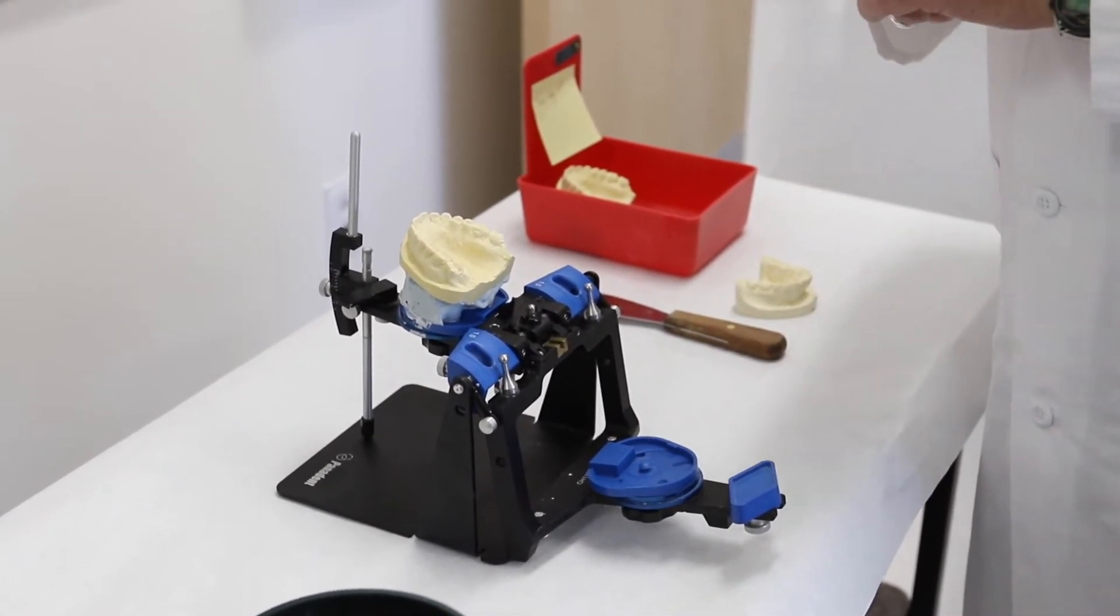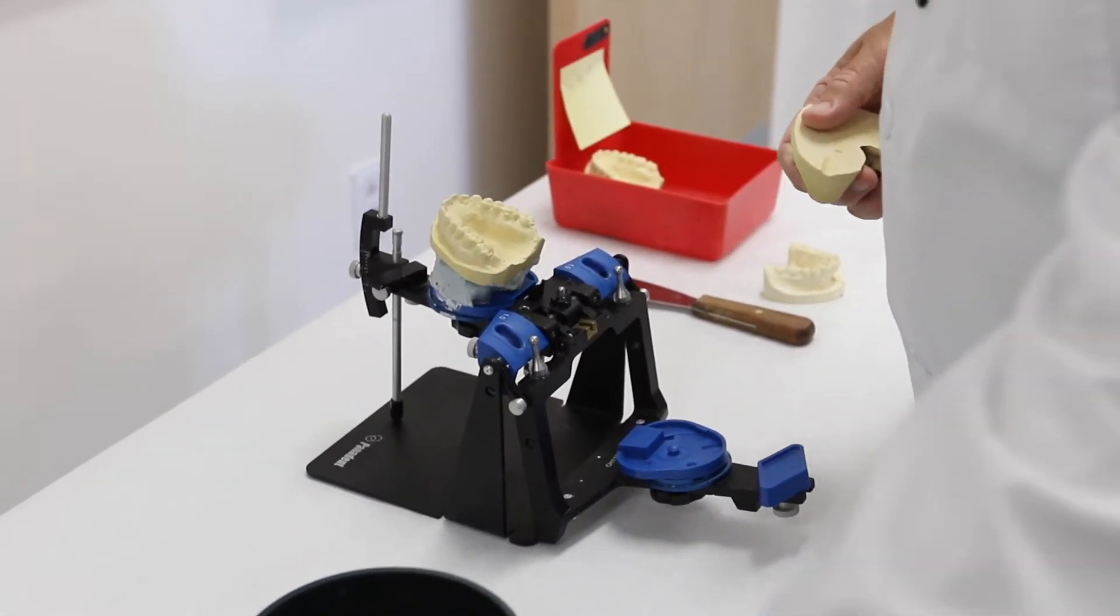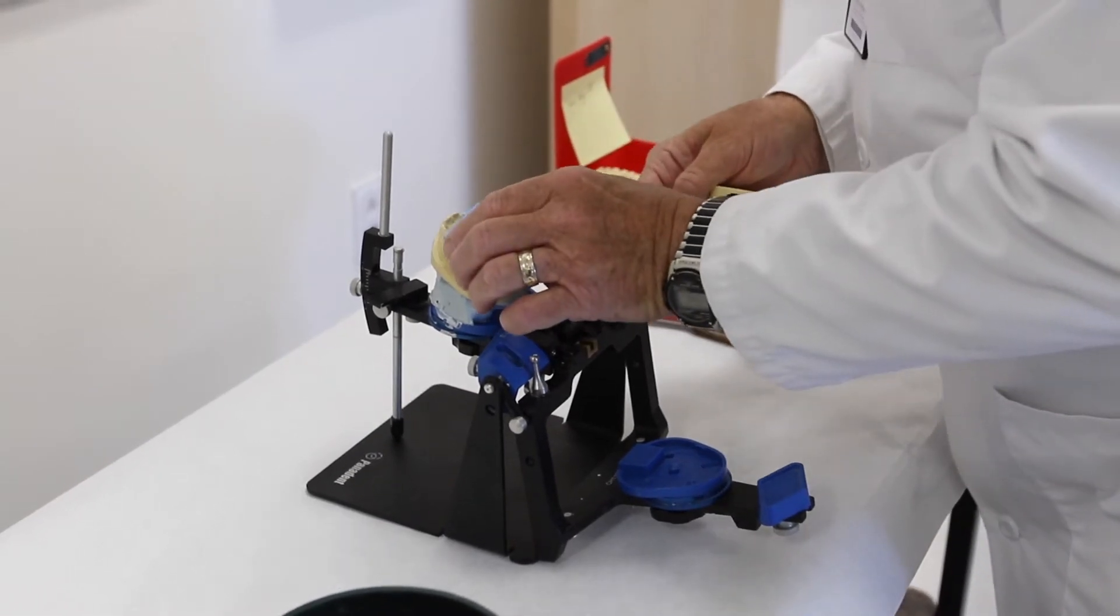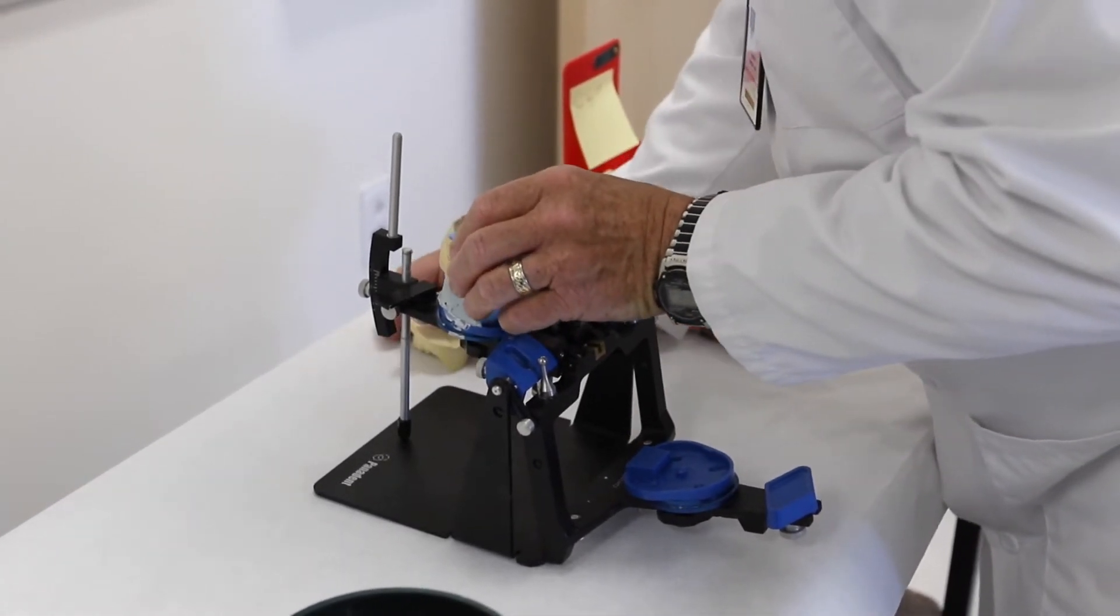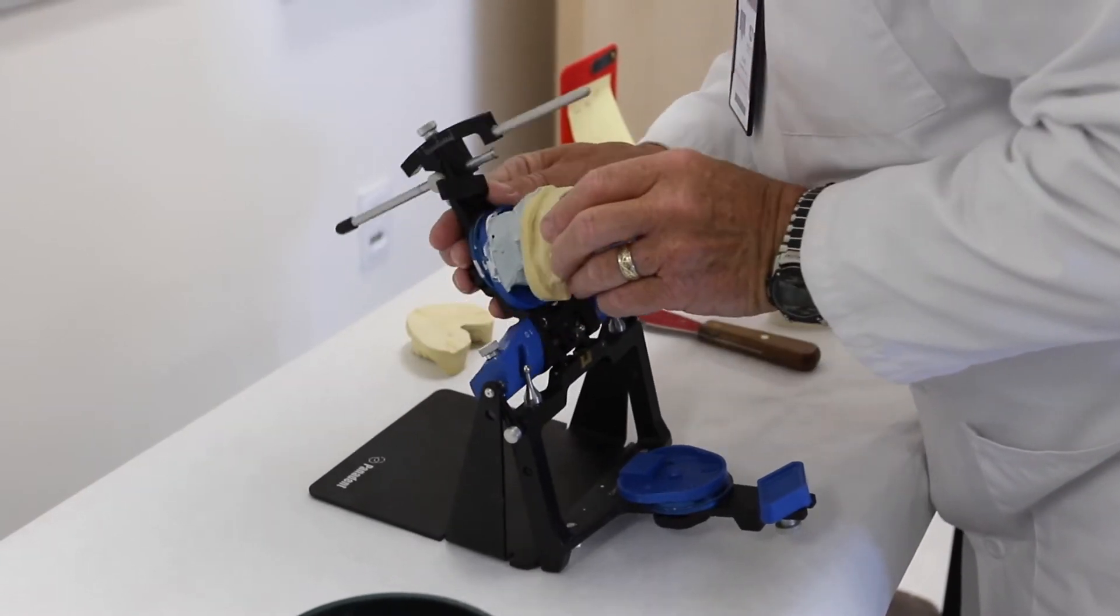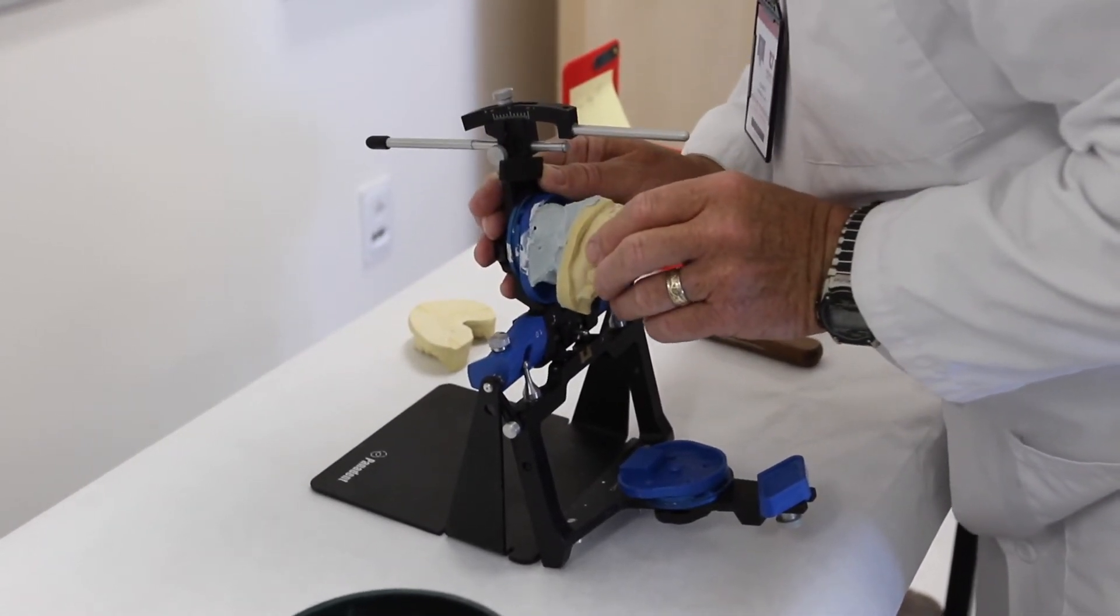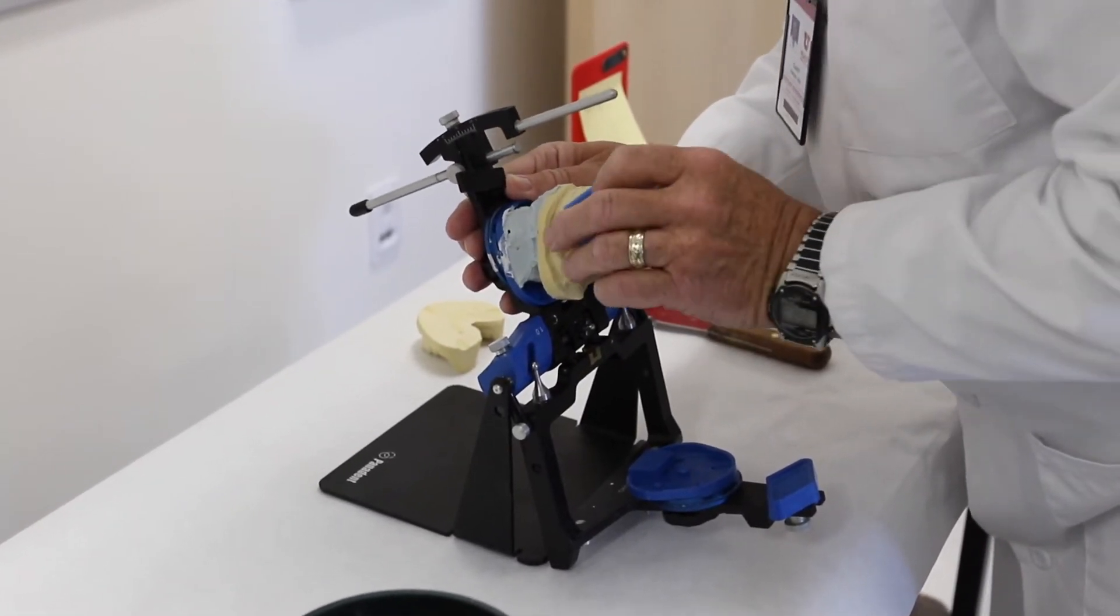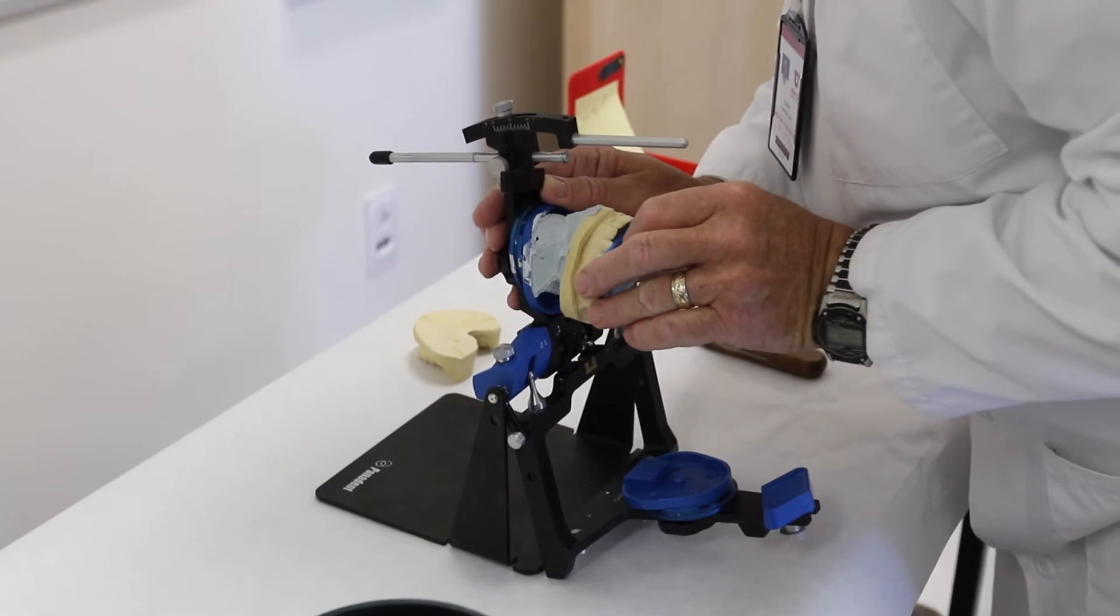So I will take the mandibular model and the wax record and we'll place the wax record on the maxillary teeth, just like they were in the patient's mouth when we did the diagnostic measurements, and get the right position.